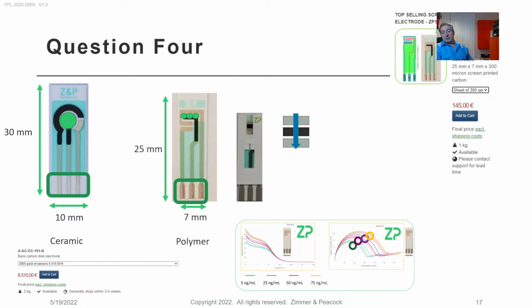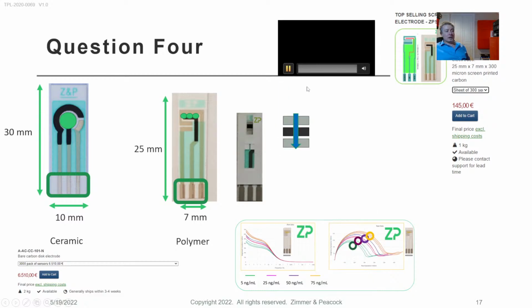So obviously with a glucose sensor, you put a drop of blood onto a glucose strip and it just starts because of this layout of geometry. That's not how the 101s will work. They have no thought about how the sample's going to come to the sensor and how the assay's immediately going to start. At ZP, we are generally thinking about that. Just play this video very quickly.